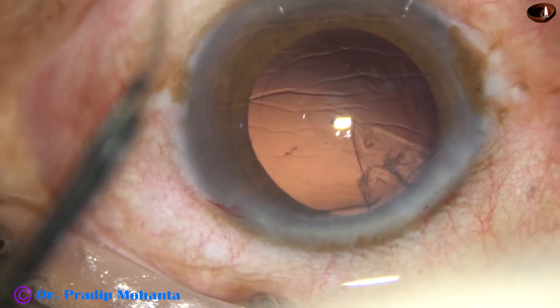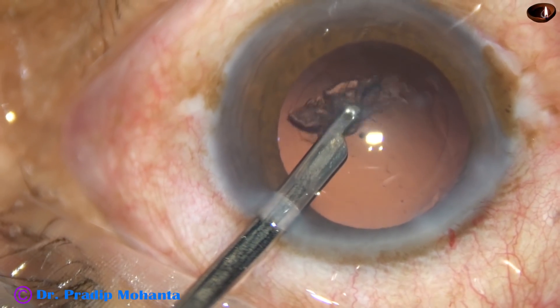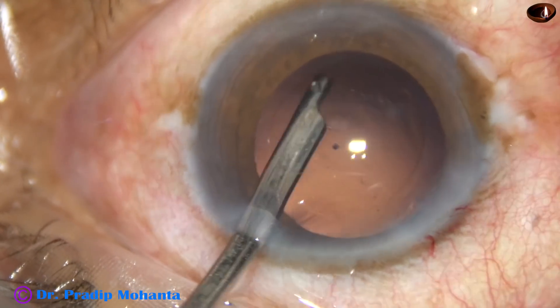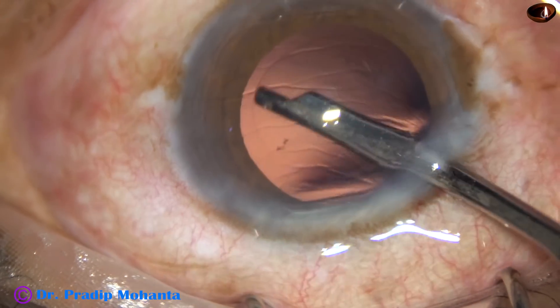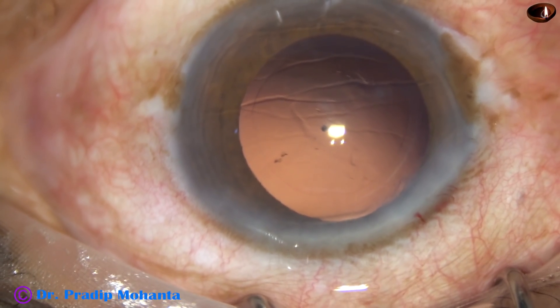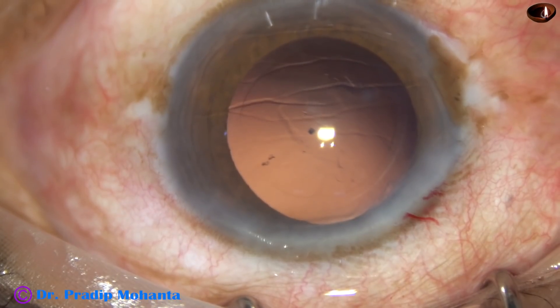Cortical cleanup can be done in many ways. In this case, a 23-gauge Simcoe cannula has been used for cortical cleanup, and this is the last bit of cortex. The posterior capsule is polished either by the cap-back mode of the phaco machine using irrigation-aspiration cannulas, or just by the irrigation cannula — the fluid jet is directed towards the posterior capsule and dislodges the cells sticking to it.